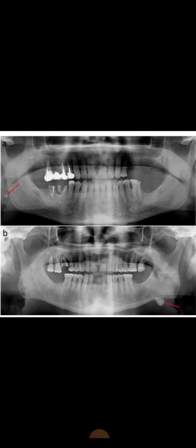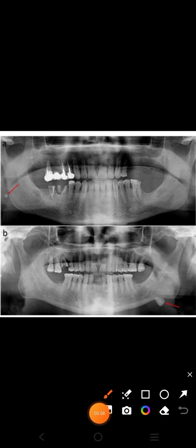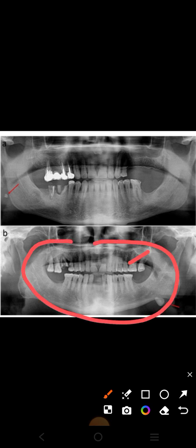The next view is the OPG view, or orthopantomogram. It is also called a panoramic radiograph. In this view you can easily appreciate the lower portion of the face - teeth can also be seen, along with the lower jaw and upper jaw clearly.